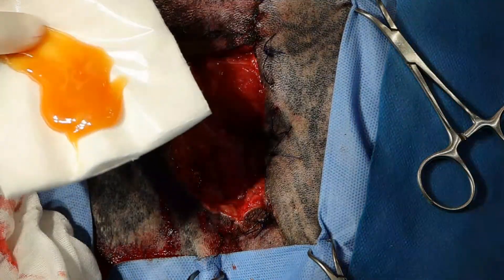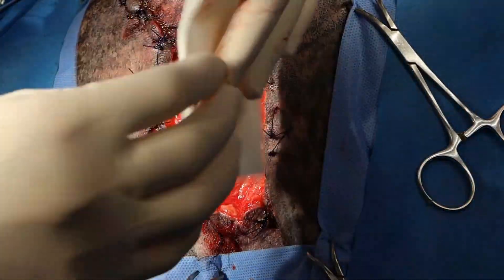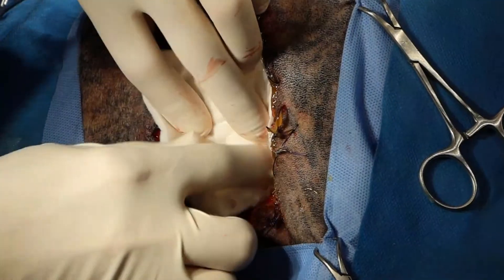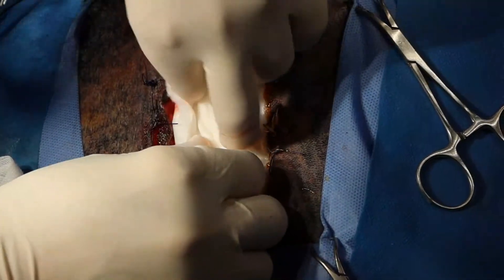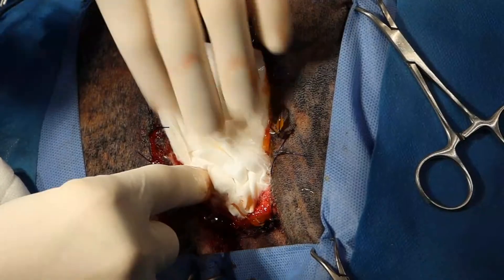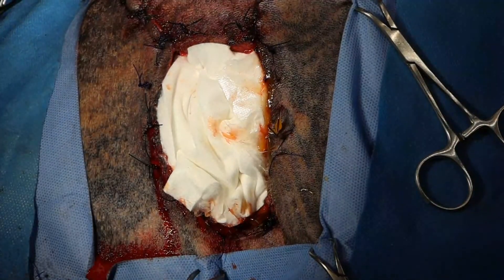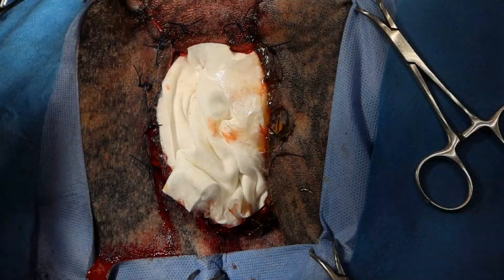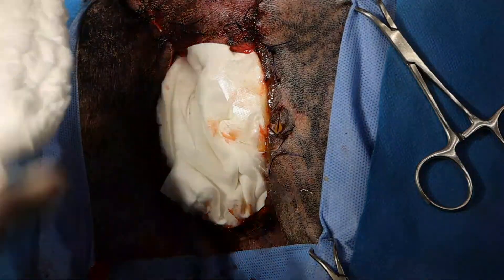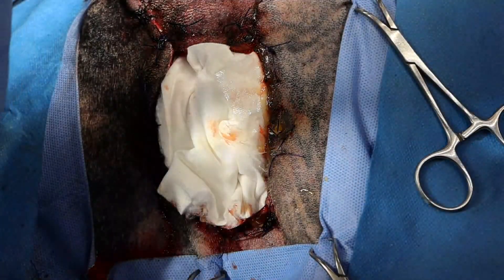All right, so I've got my honey here. I'll pack that in here. Smells so good. And then I'll use a lap sponge. Cut off the x-ray tape.